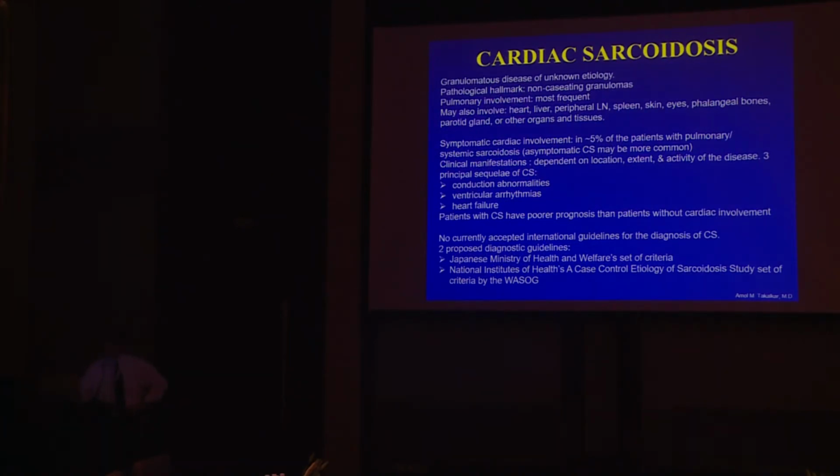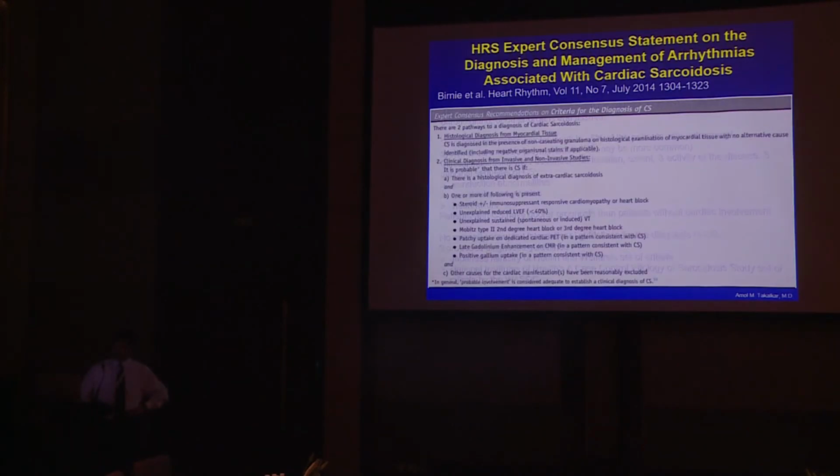Moving on to cardiac sarcoidosis, this is where you actually want to suppress the normal myocardial uptake. So in patients who have extra cardiac biopsy-proven sarcoidosis and relevant signs and symptoms like abnormal EKG, palpitations, arrhythmias, and something that evokes suspicion, these basically need to be evaluated for cardiac sarcoidosis, because if the cardiac involvement of sarcoidosis is found, then these patients have poorer prognosis.